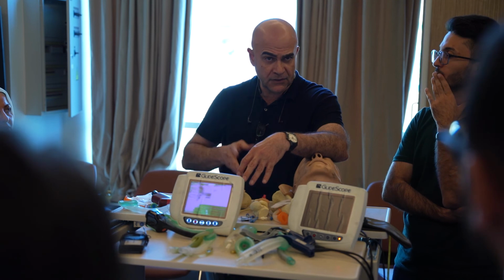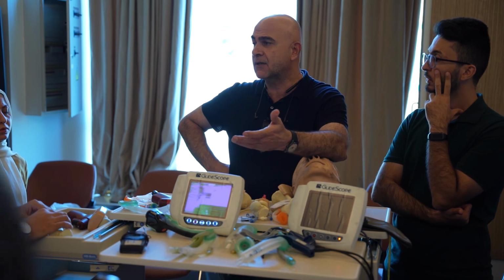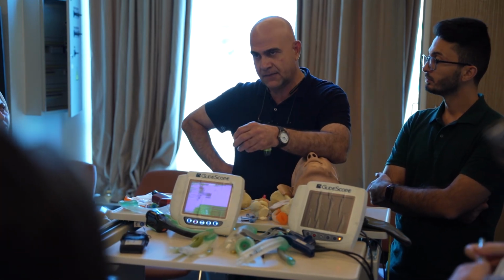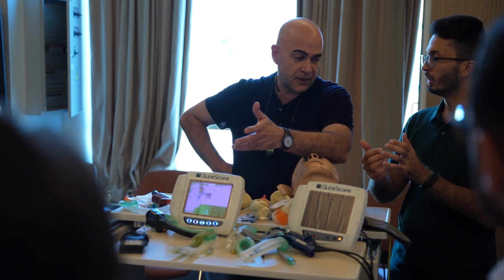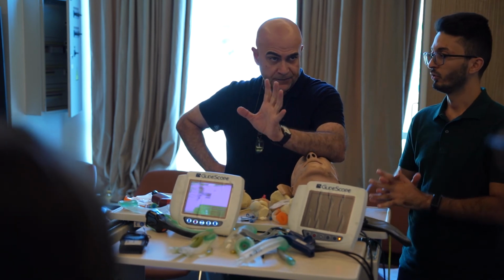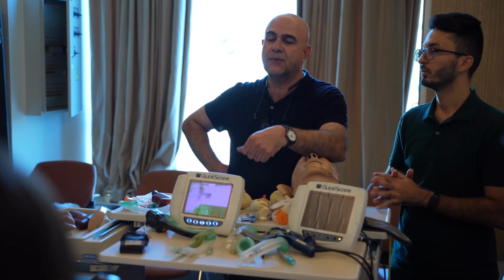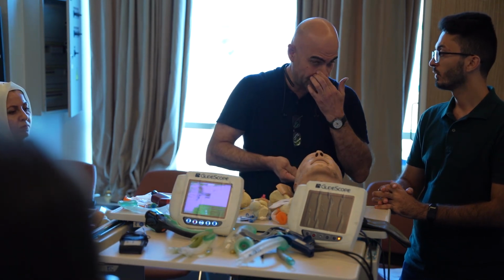Your target of oxygenation by pulse oximeter is 94 plus, unless the patient has COPD. You are going to use controlled oxygen supply, 88 to 92. Now the patient is unconscious. You put the patient in supine position, doing maneuvers: head tilt, chin lift, and if you suspect cervical spine injury, jaw thrust. Now we look into the mouth using suction and a basic airway. By putting a suction tube, you can see whether the gag reflex is present or not.